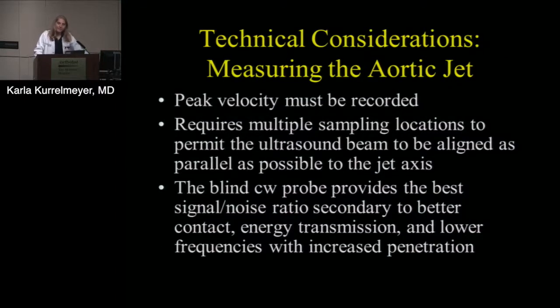I think probably the thing that I see the most with the sonographers, though, which is probably the most important, is making sure that you are aligned parallel with that stenotic aortic stenosis jet. And you've got to remember, that's a small jet, because some of these valves, especially when they're severely calcified and stenotic, it's just a pinhole going through there. So you really have to sample in multiple different locations. And you really have to use the blind PEDOF probe. Why? Because it's very steerable, and it allows you to angle it and get in between the ribs and really try and get parallel with that jet.